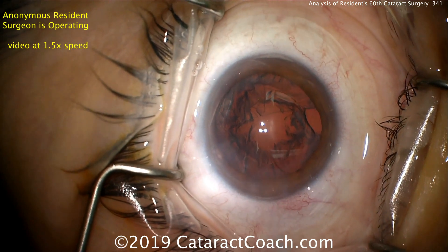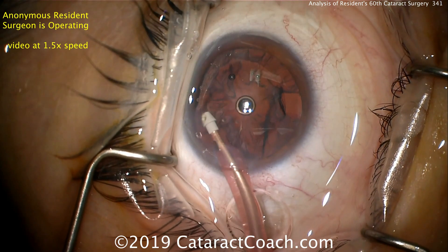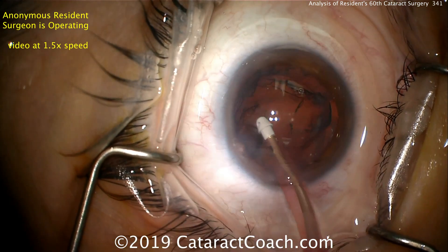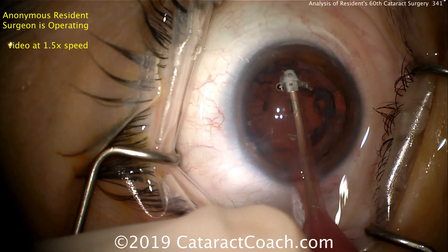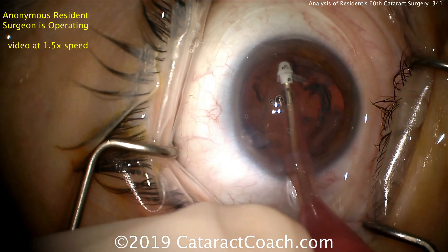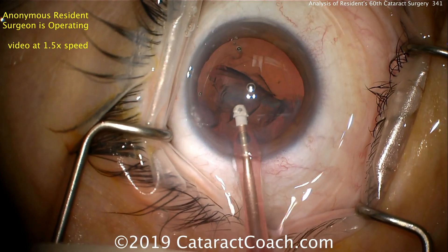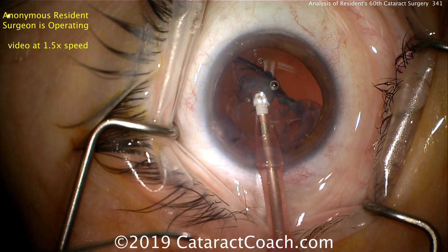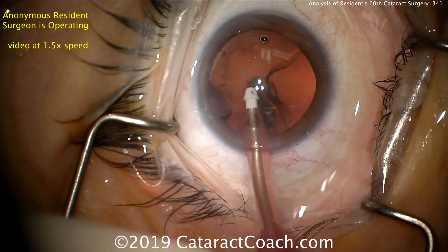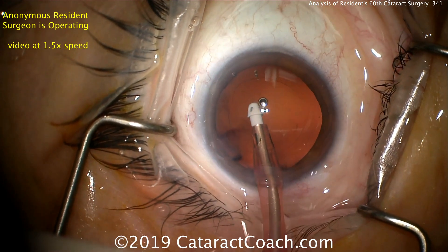Now it's time for cortex removal. Looking at the draping of the lashes — it's pretty good. Looks like on the left side the superior lashes are draped well. This looks like a right eye with a temporal incision. The inferior lashes are a little bit exposed — that could be worked on for the future. Now removing lens cortex using the I/A probe. I would adjust the I/A sleeve so that it's further down the tip — right now the infusion ports are too far away from the aspiration. So when the surgeon pulls backwards to try to get the subincisional cortex, you have a danger of having infusion exit the eye. So maybe adjust that sleeve next time to have it in a better position.